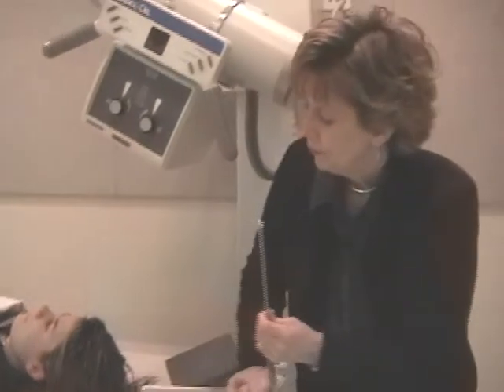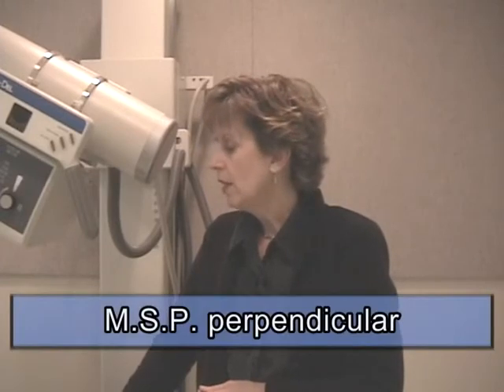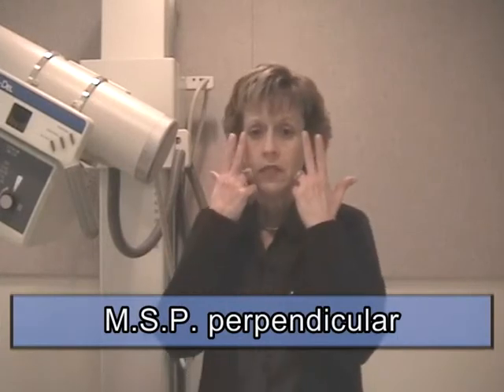And 10 by 12 film, ID to the bottom. Film's edge should be level with or up to 1 inch below the vertex of the skull. MSP should be to the center, and I want the MSP perpendicular. That will put the distance from the outer canthus to the lateral border of the skull equal on both sides. And that's our AP axial.